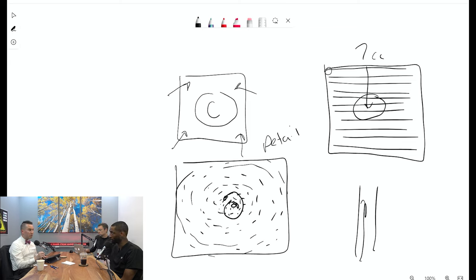If you're going to do it that way, though, you have to hit the bolus right. If you're doing a care bolus or a fluoro trigger, you're going to have to wait for the carotid to be fully opacified, or very close to it, before you hit go. Because if you're using your old school timing of when the lungs blush, I've already filled the center of K space way before the contrast actually entered the carotids. So if you have a long time to center, you've got to start that scan so that you're filling the center of K space when the carotid is filled with contrast. Make sense? For sure. So this is a lot better, this elliptic centric or 3D centric reordering, depending on what vendor you've got.